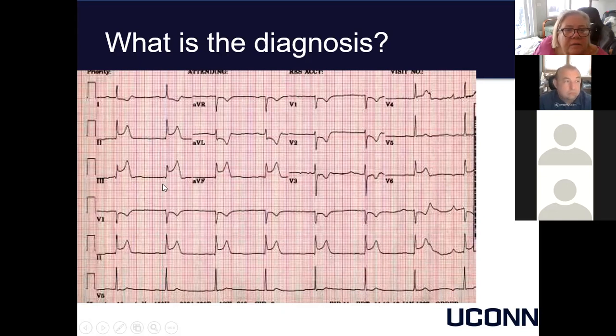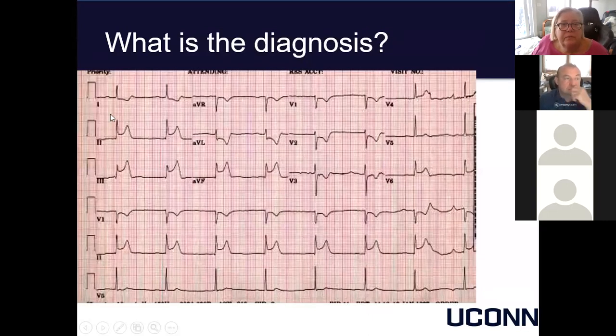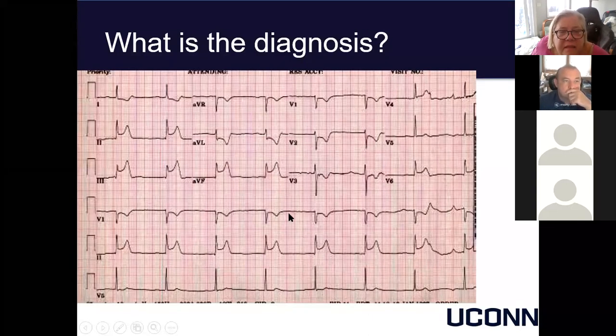And then is that ST elevation in the second lead? Yeah, exactly. The elevated ST in 2, 3, and F. And I think this is slow.